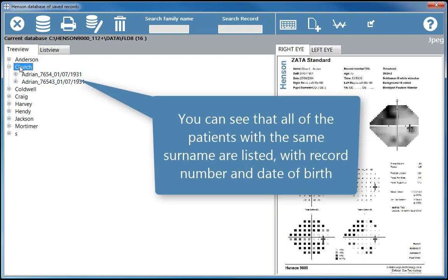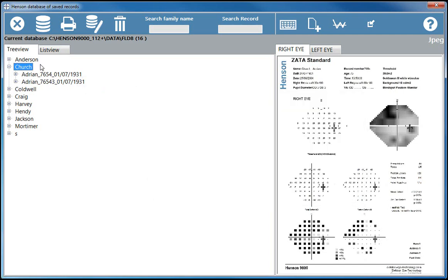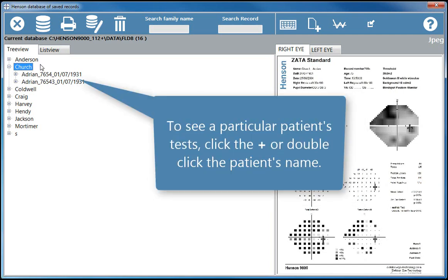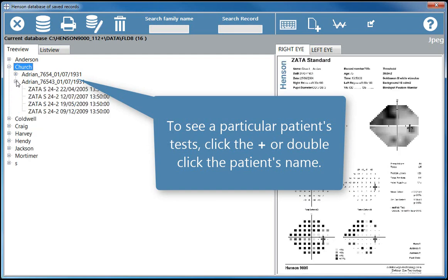You can see that all of the patients with the same surname are listed with record number and date of birth. To see a particular patient's tests, click the plus or double click the patient's name.